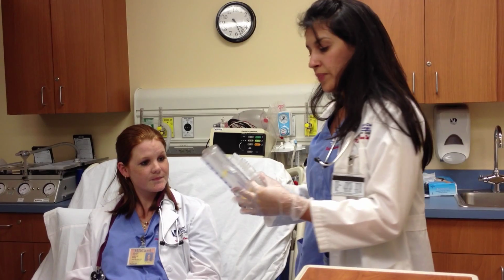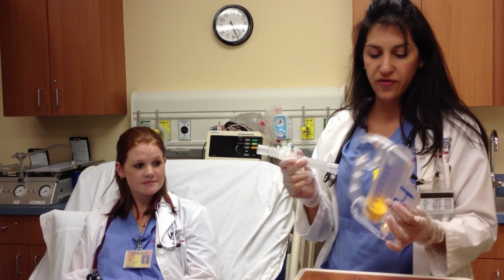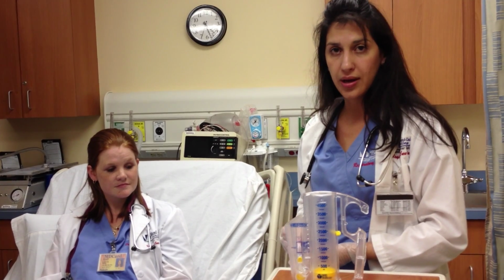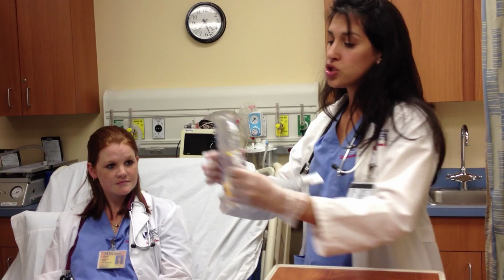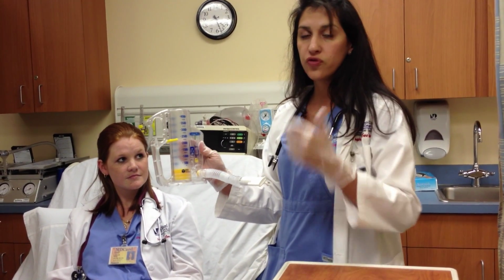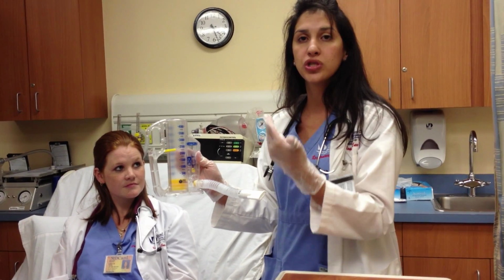So this is the patient's tubing, this is the mouthpiece, and I'm going to assemble the equipment for my patient. The way you set a target volume for your patient is by the age and height. My patient is 25 years old and 63 inches, so you will set the goal for 2,500 milliliters. You try to have achievable goals set for your patients.